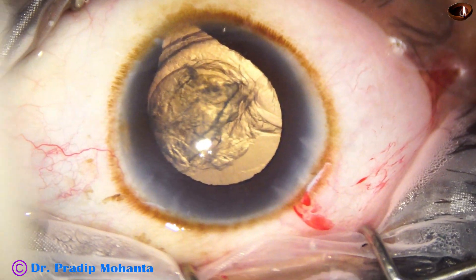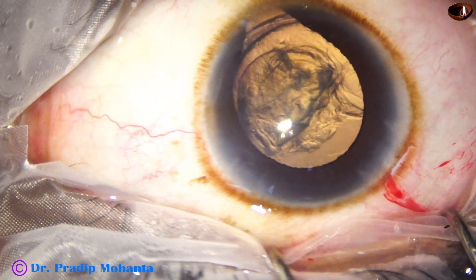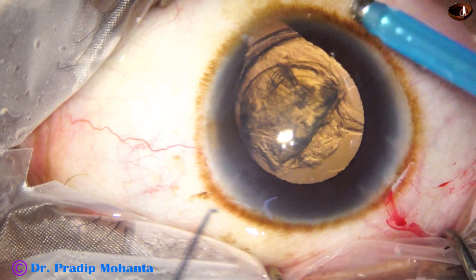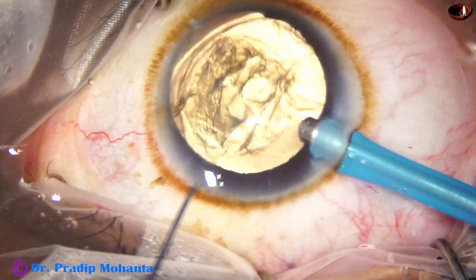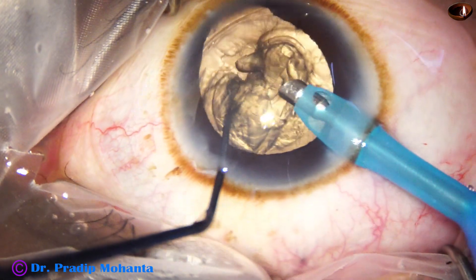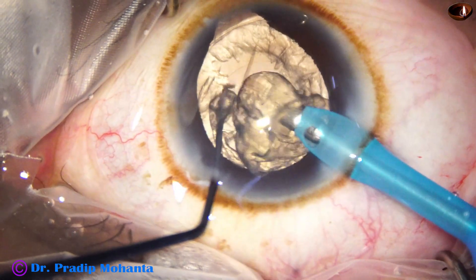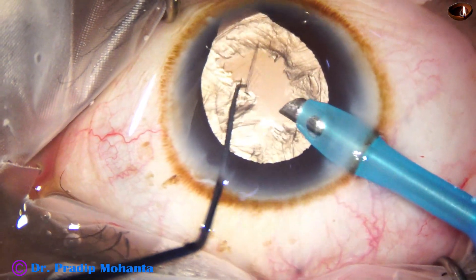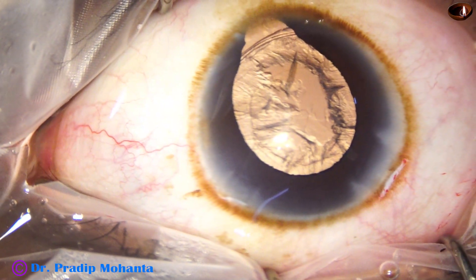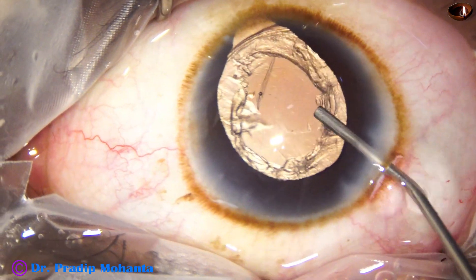Now is the time to introduce the phaco needle. In this case, very little ultrasonic energy — maybe 10% — was used intermittently, and the whole nuclear mass and lens matter came out within a few seconds. Some visco is added.